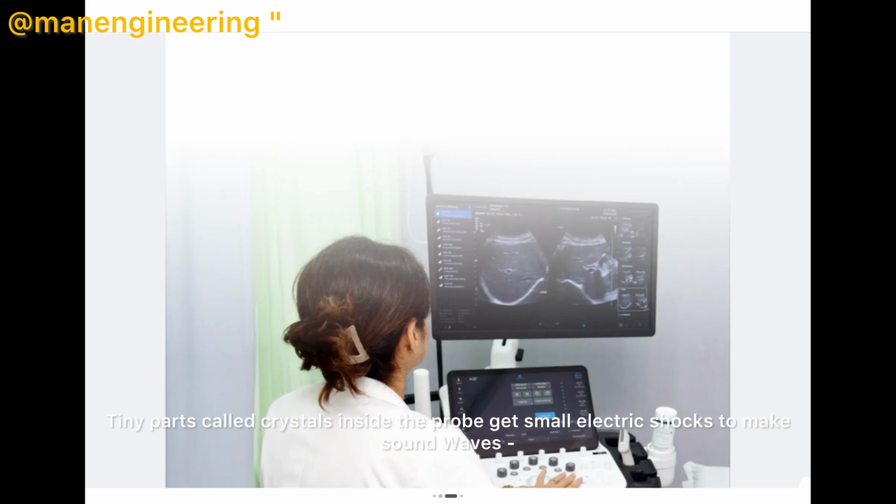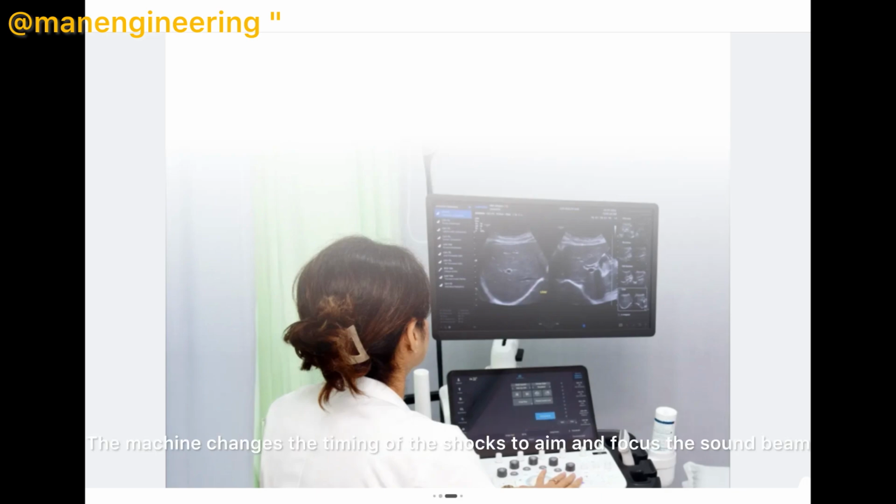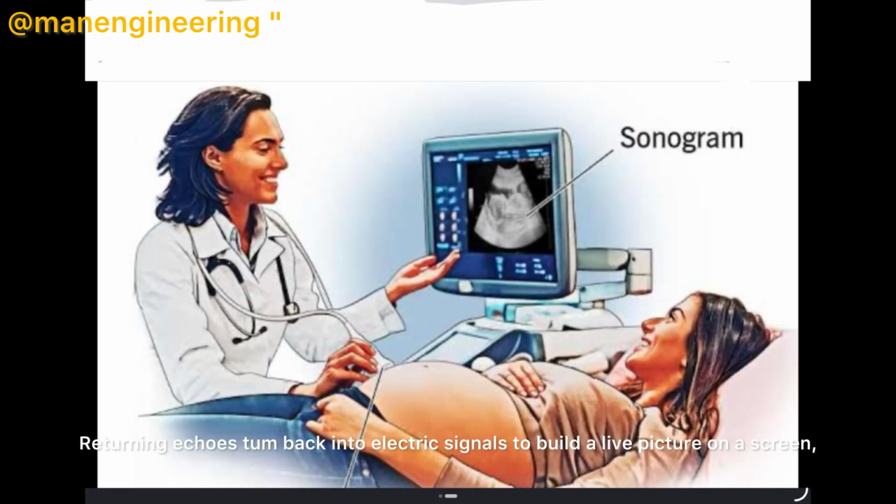Operation. Tiny parts called crystals inside the probe get small electric shocks to make sound waves. The machine changes the timing of the shocks to aim and focus the sound beam. Returning echoes are turned back into electric signals to build a live picture on a screen.